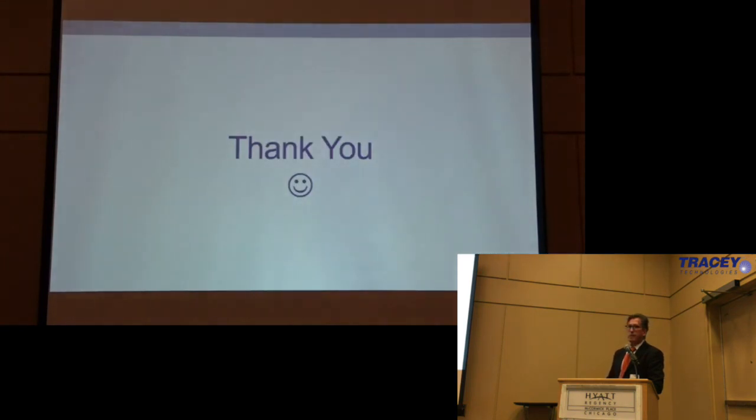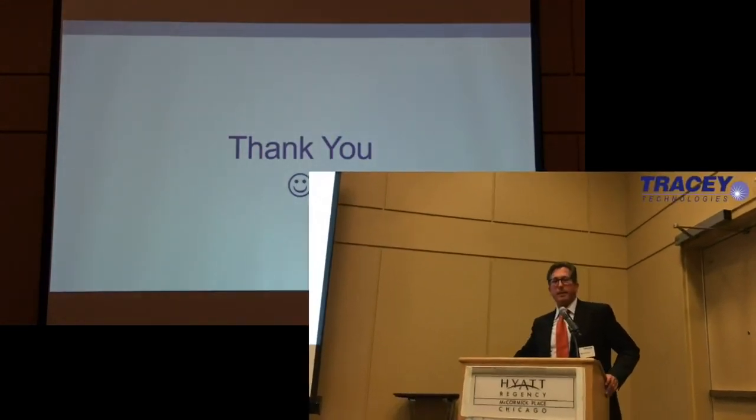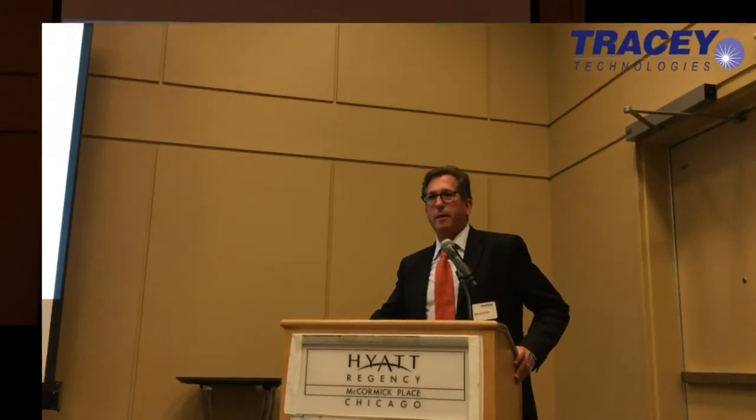So in summary, use your iTrace, get to know it. It's really a great tool for helping you separate what you can do for any given patient.